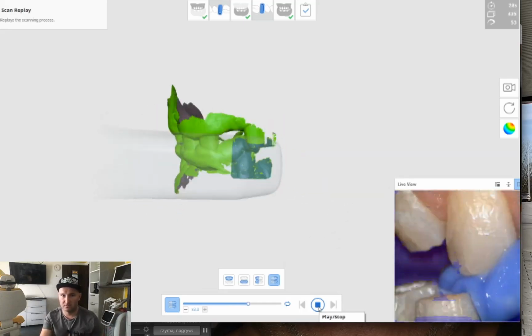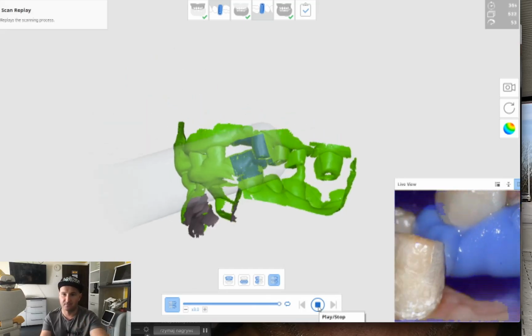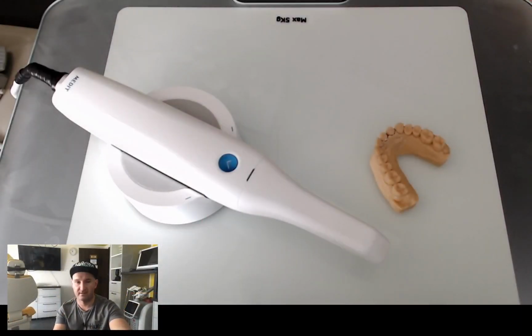and then the program will get much more information about the occlusal plane. Here is the constructional occlusion. So we just, because we went with preparing all the teeth, we lost our vertical dimension, so we need to register it in constructional occlusion, but in fact it doesn't matter, the idea is the same.